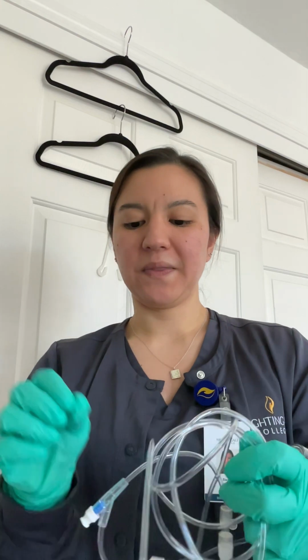All right. The Y site. This is where you're going to be inserting a medication or another fluid that you are going to be attaching to this IV. The adapter site, this is where it's going to be going into the patient.